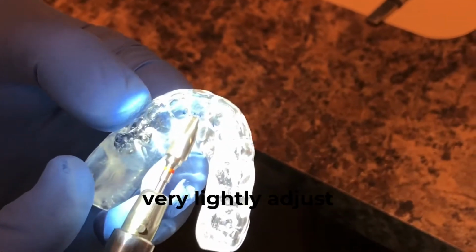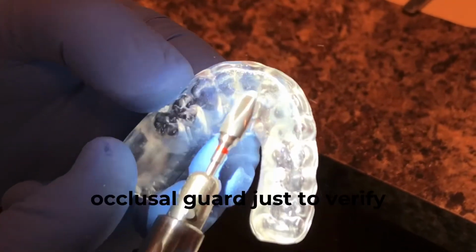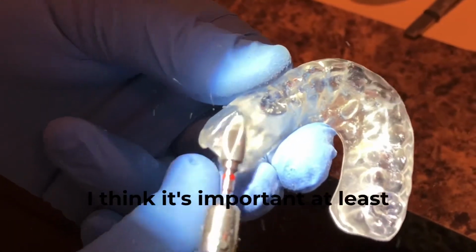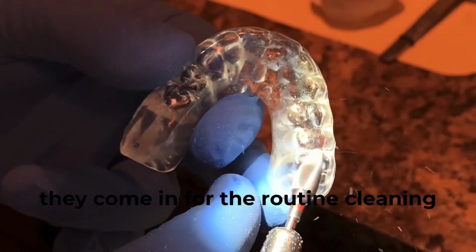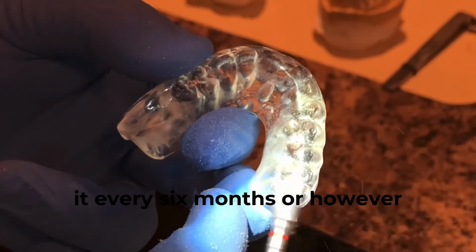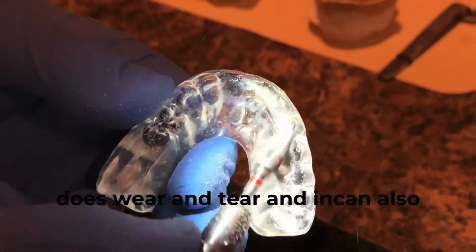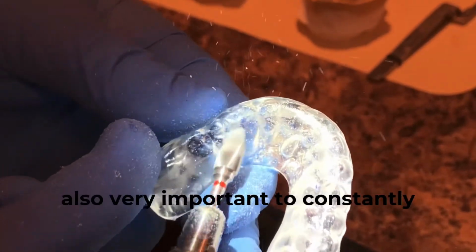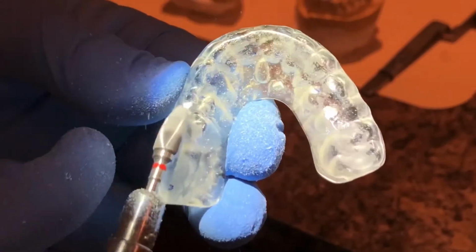Sometimes I could very lightly adjust little heavy contacts on the occlusal guard just to verify that they're hitting equally. And I think it's important, at least in my practice, that the patients bring in their mouth guard when they come in for their routine cleanings for me to equilibrate or adjust it every 6 months, or however often they come in for the cleanings. Because as they chew on this, it does wear, and it can also chew where it's unequal. It's very important to constantly have it balanced. So I could very quickly just do a little adjustment, and that's important.